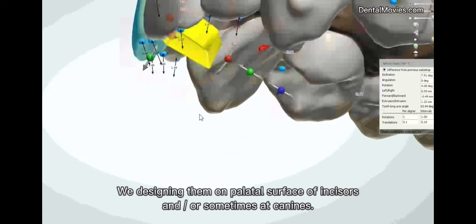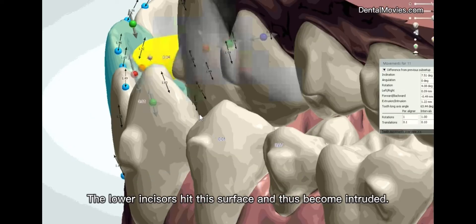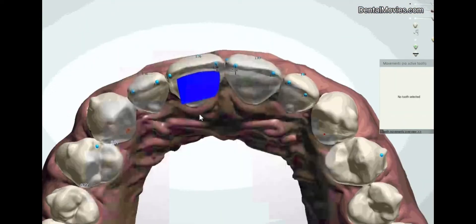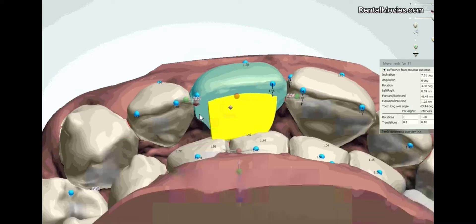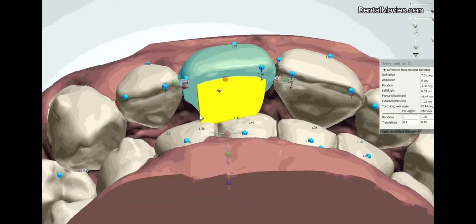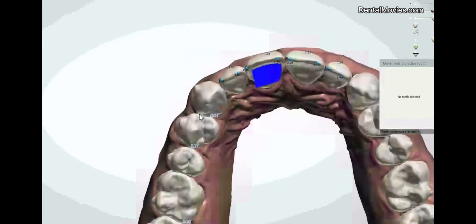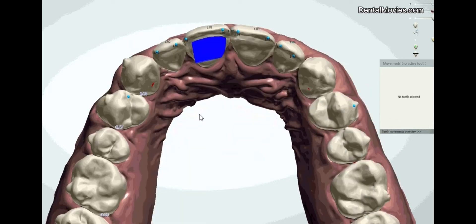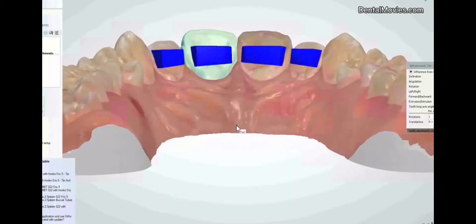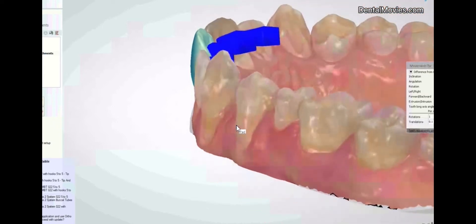We're designing them on the palatal surface of incisors, and sometimes at canines. We try to make them as big as possible. The lower incisors hit this surface and thus become intruded. Thank you.